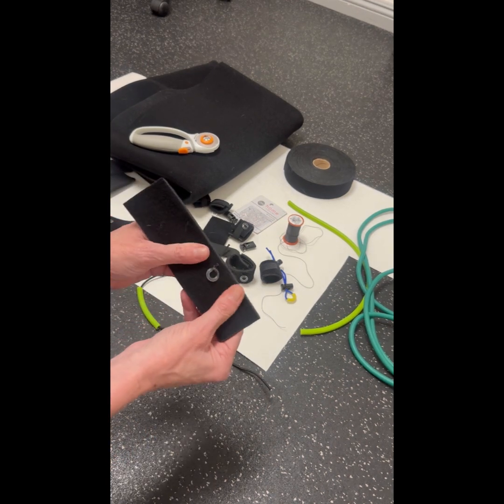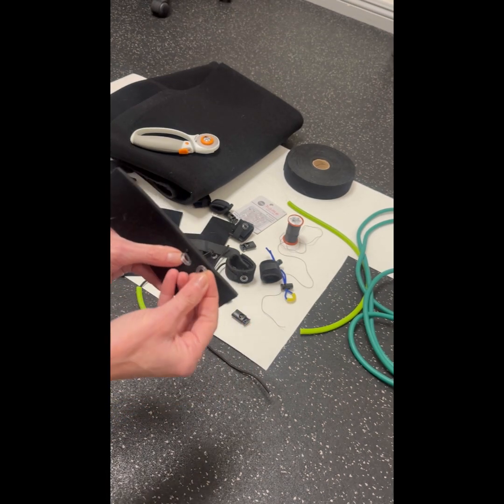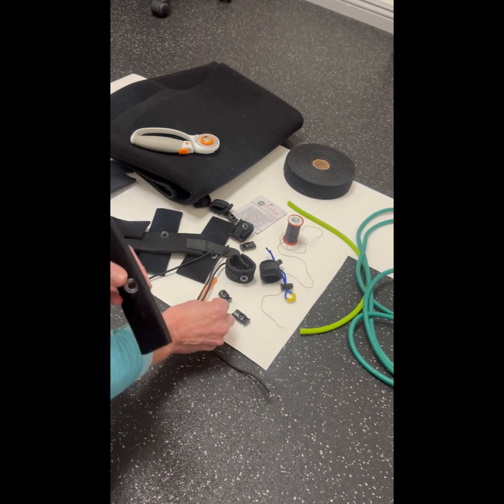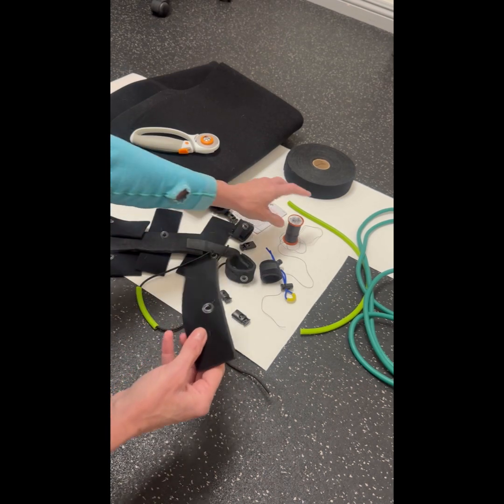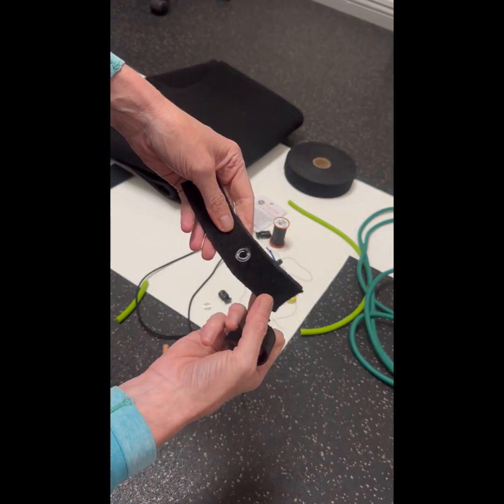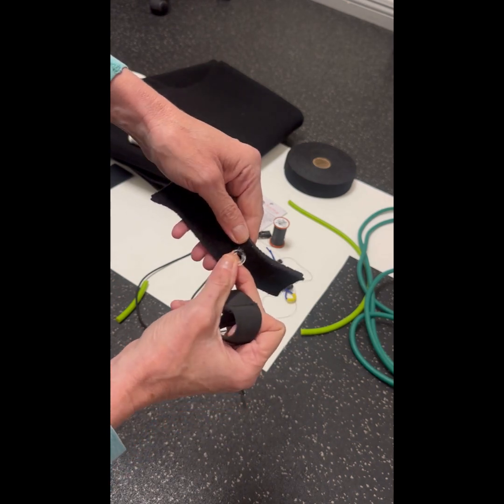Once I have the piece of neoprene, I'm going to sew on a little plastic ring. This is a half inch plastic ring that I sewed on by hand using some upholstery thread. Now that I've cut out my piece of neoprene and sewed on my half inch plastic ring, I'm ready for the next step.